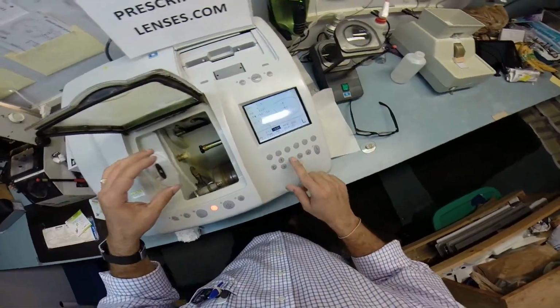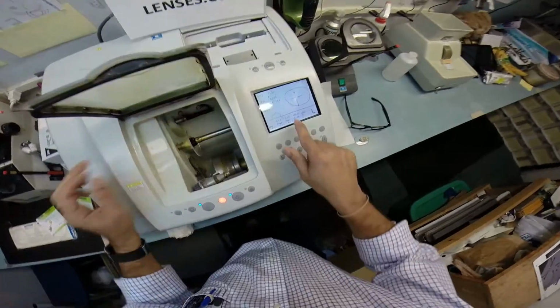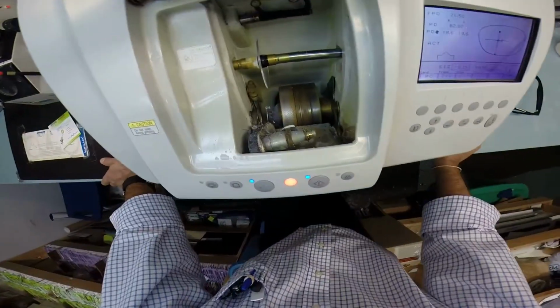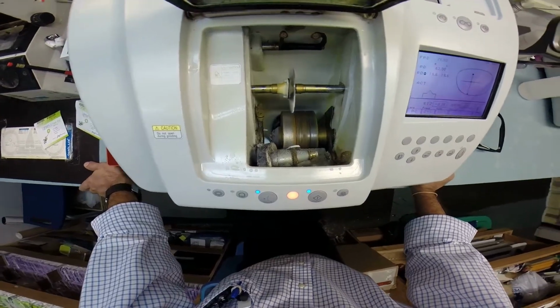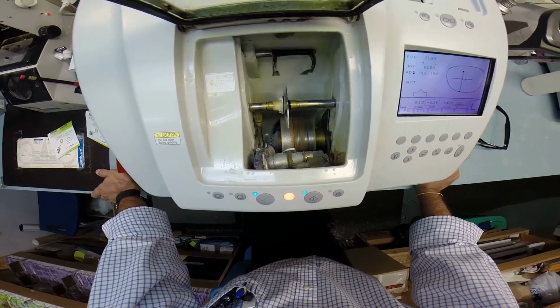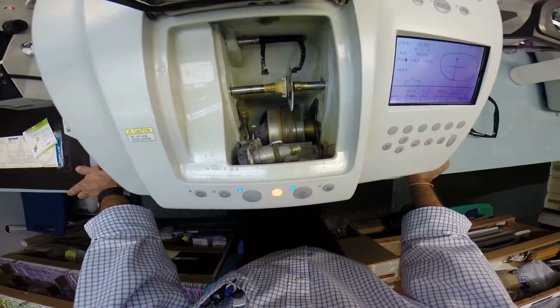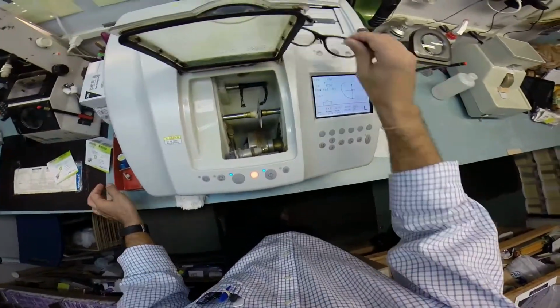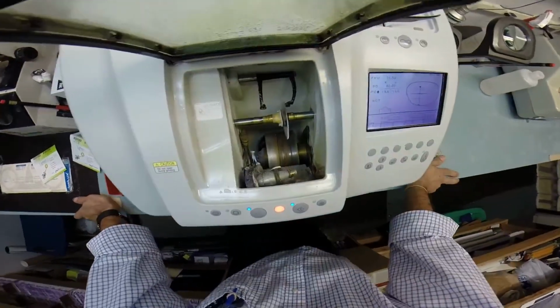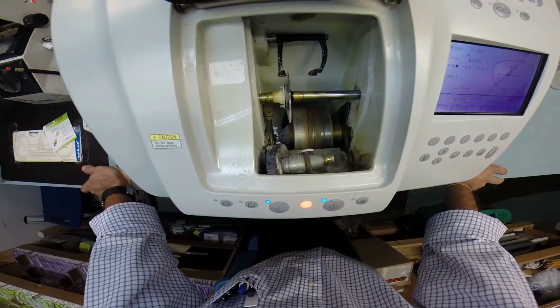And let's go ahead and start cutting the left lens. I left it out on purpose, and you will see why. I took it down 1/10 of a millimeter more because this will help you years from now. Should you ever need more prescription lenses, you'll be able to pop these out and put the new ones in at home. So just like before, it's starting with the back surface. Of course, this time it's tracing the left side to make sure the lens is large enough to fit. Then it's going to move over and trace the front surface. There you go. I knew you could do it.